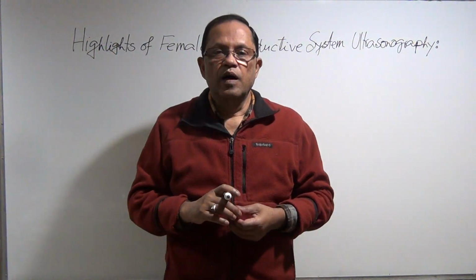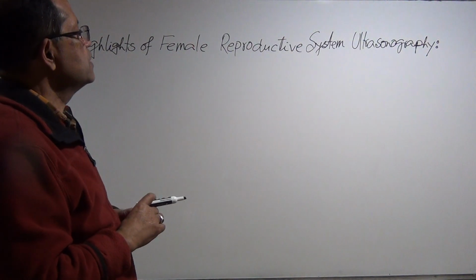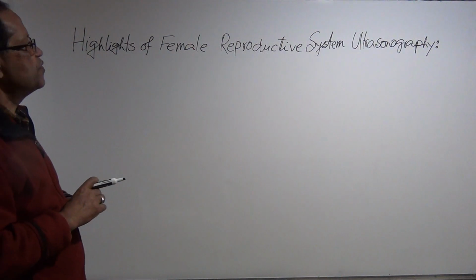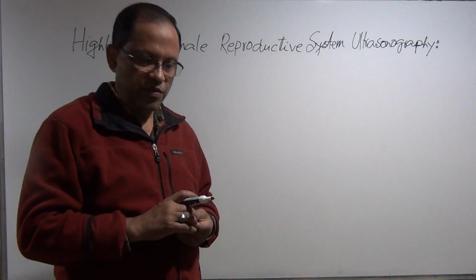Ayub. Today, I will start my lecture on highlights of female reproductive system ultrasonography.